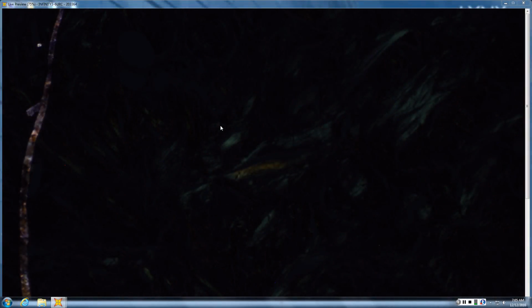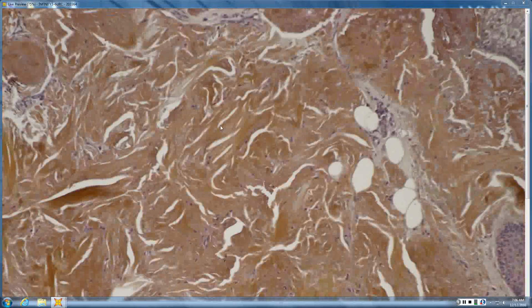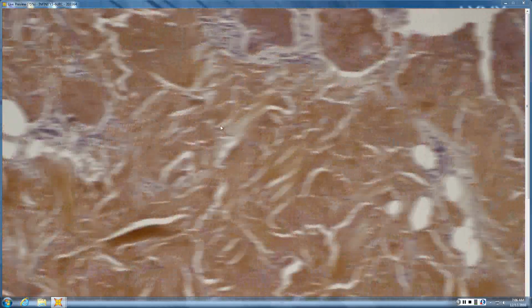You do have to be careful and make sure that you're in the amyloid when you're looking for it, because collagen can sometimes do it, which is not very helpful. But this is clearly within the amyloid. And then just based on the brick red staining without polarizing it, that's probably the most positive Congo red I've ever seen in my whole life. So, alright, so nodular.